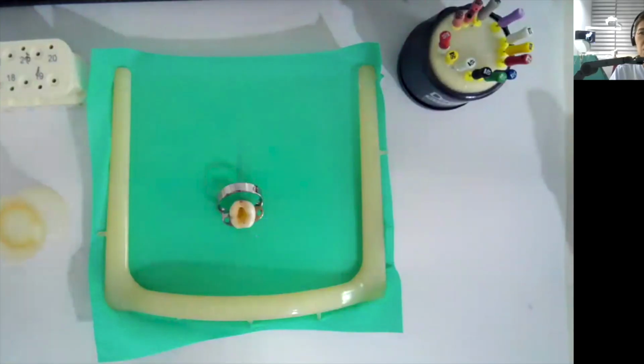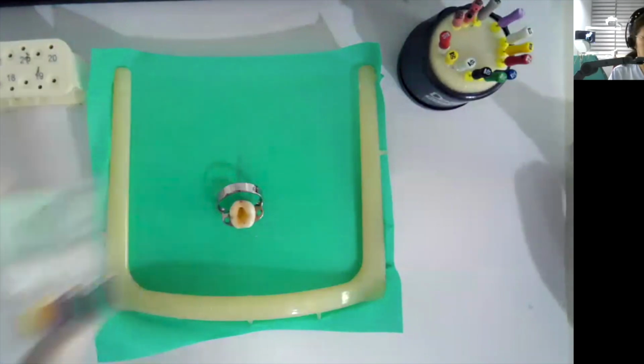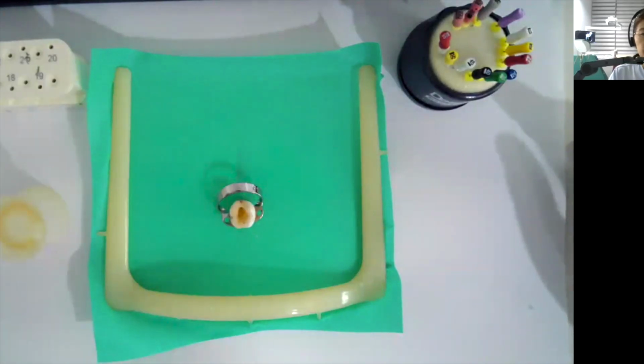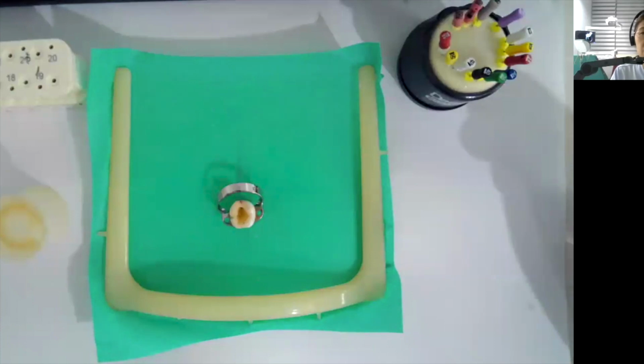Good afternoon, everyone. Today I'm going to demonstrate how to enlarge the canal using RT files as well as the glide finder. First, we should have the preoperative radiograph. My tooth length image is 23 millimeters. When I do the apical patency, I just have to add 0.5 of a millimeter.